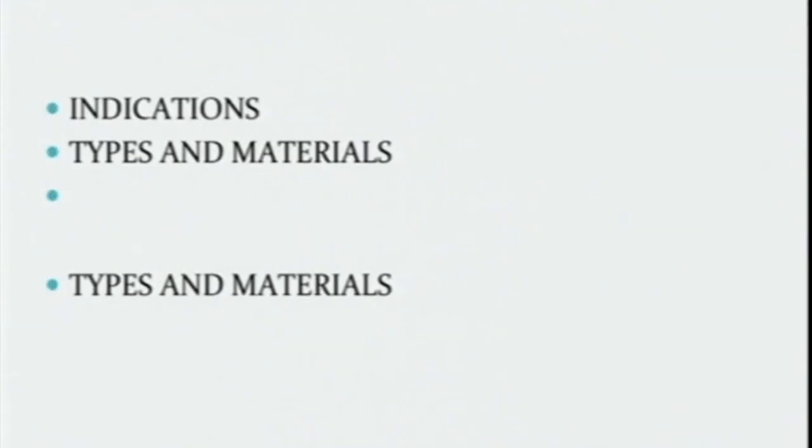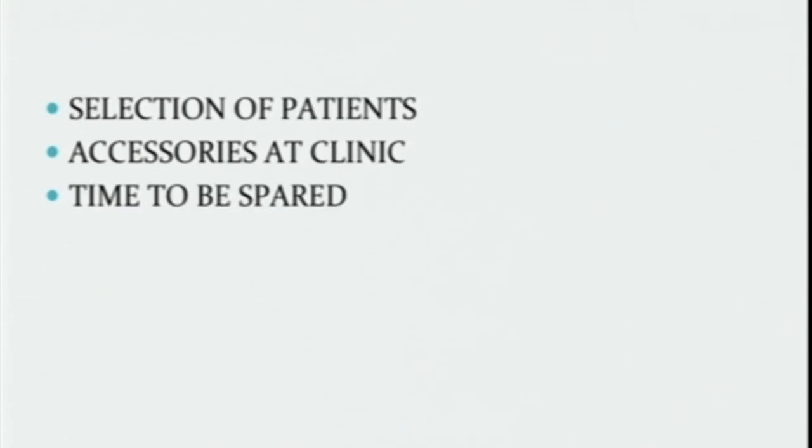So, the indications for contact lens: the highly motivated patient and a high refractive error, that is more important. And we'll have to go through the types and materials of the contact lenses, selection of patients, accessories which are needed at the clinic, and the time to be spared. Selection of patients is a motivated patient and anisometropic patient. We'll have indications later. Accessories, the routine refraction set which you have in your clinic is more than sufficient.